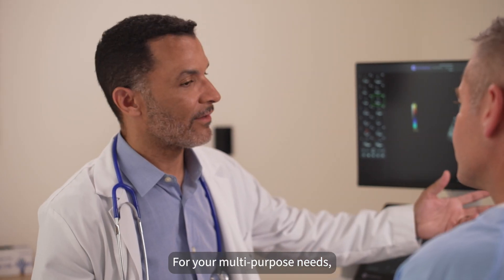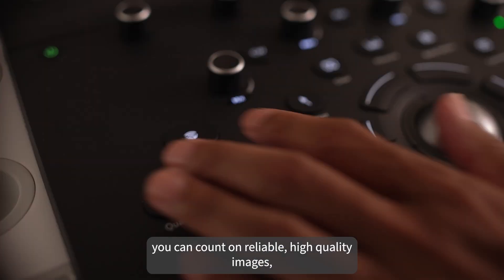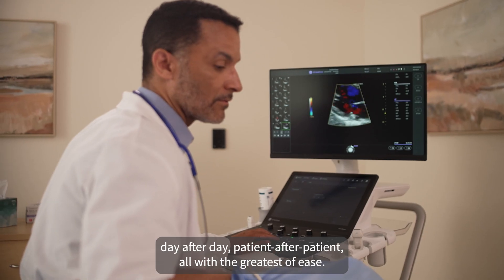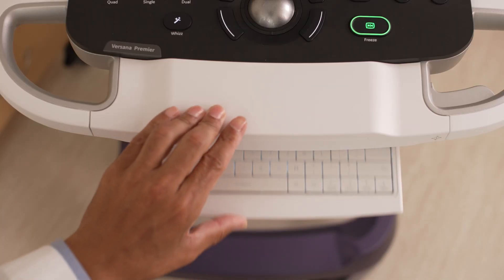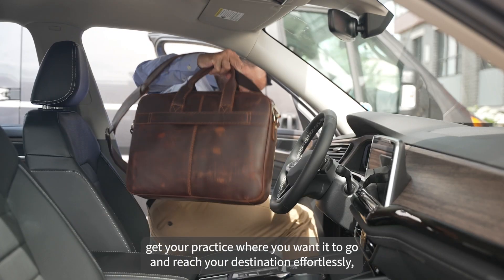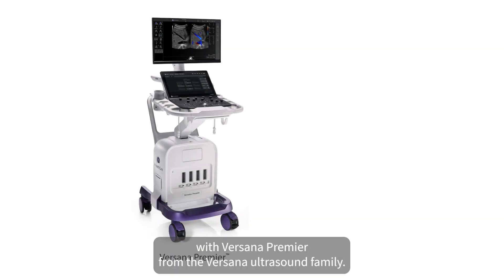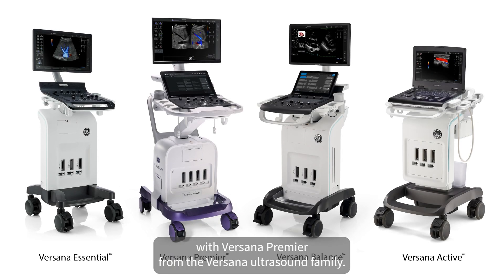For your multi-purpose needs, you can count on reliable, high-quality images day after day, patient after patient, all with the greatest of ease. Accelerate your productivity, get your practice where you want it to go, and reach your destination effortlessly with Versana Premier from the Versana Ultrasound family.